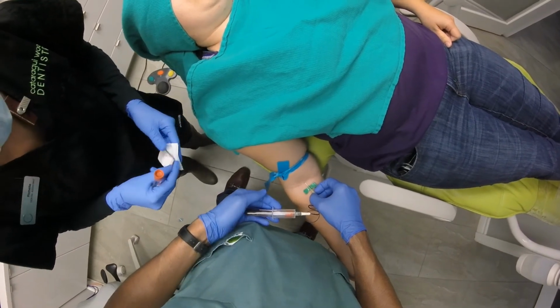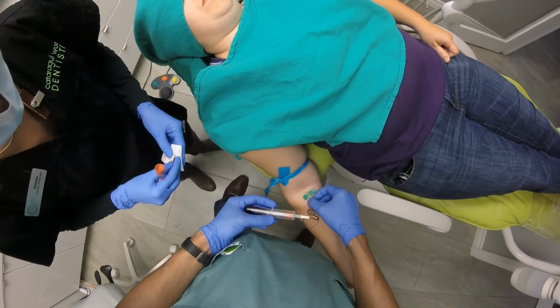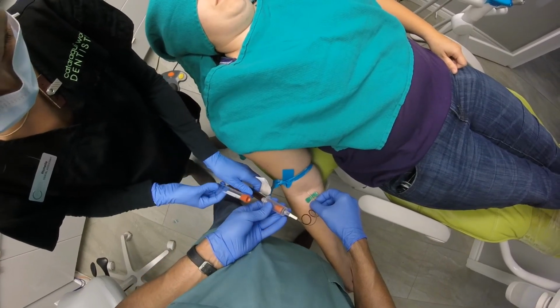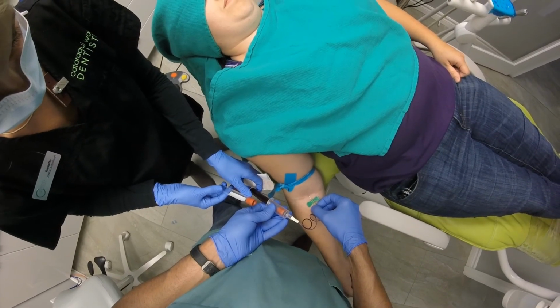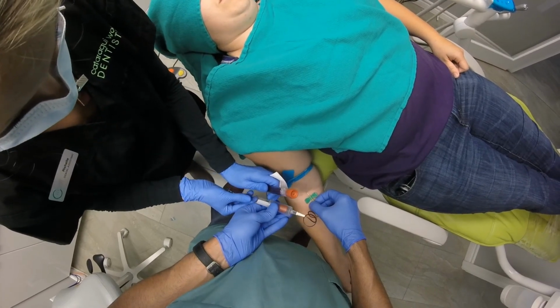I now have attached the vacutainer to the vacutainer holder, holding the other extra bottle. A small pinch for the patient here. Engage the bottle, which has a vacuum once the needle goes into the skin, and you'll see that we can start drawing some blood right away. And there we go. Usually I like to have the vacutainers facing towards me so you can see the blood filling into the vacutainer tube.